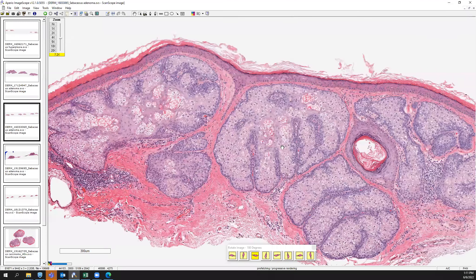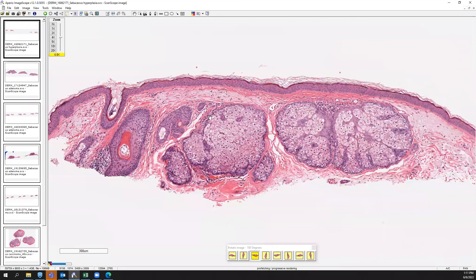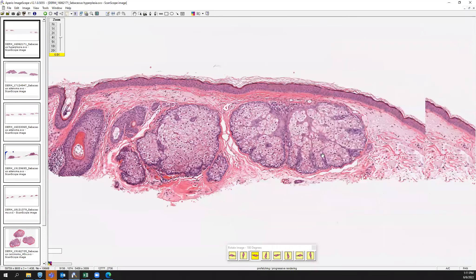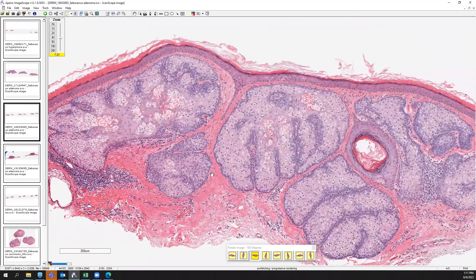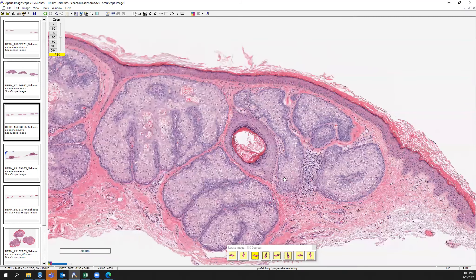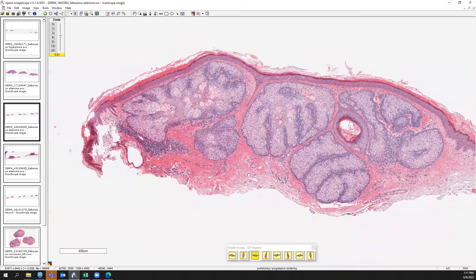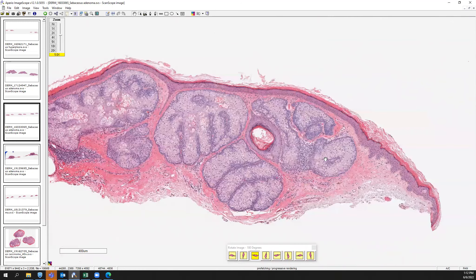Here's another example of a sebaceous adenoma. You can see well-formed lobules, and on the outer rim of those lobules you'll notice a thicker blue compared to sebaceous hyperplasia, where you mainly have that whitish, well-differentiated sebocyte presence. Going back to that example of sebaceous adenoma, you can see how if you just got a piece of this it'd be tricky to say sebaceous hyperplasia versus adenoma. This one was called sebaceous adenoma, but it's a little bit more borderline.